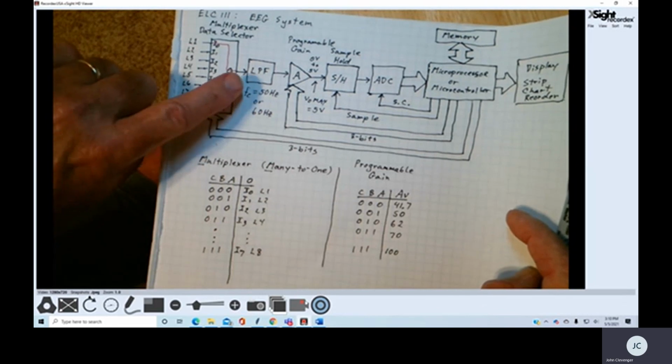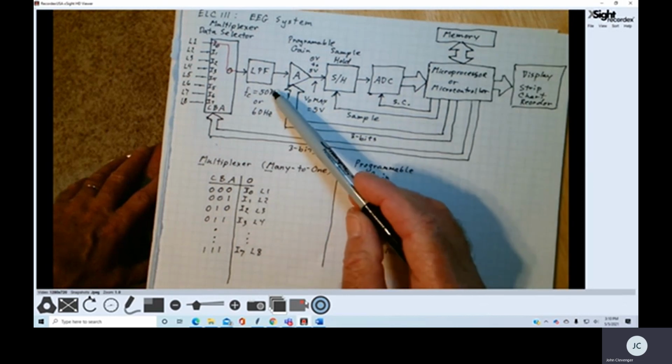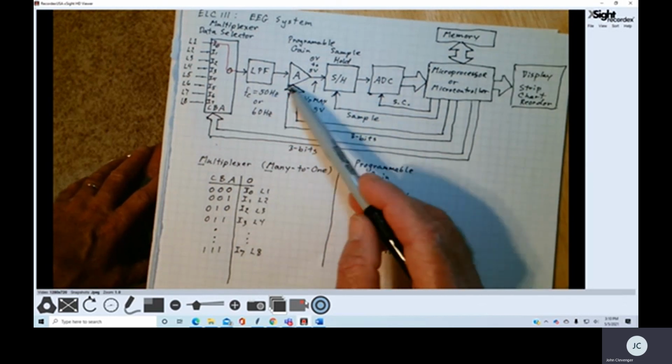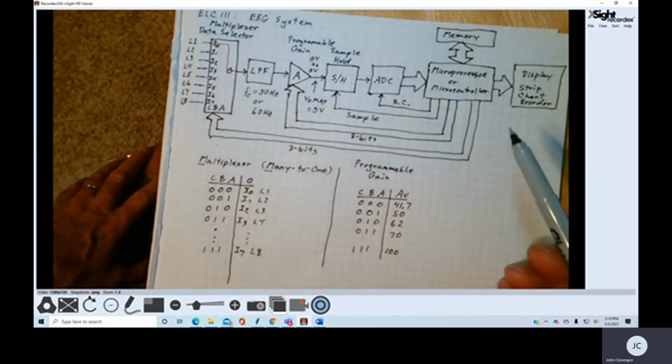We just take this low pass filter as this block. Don't really care about what's inside of here, the capacitors, the resistors. We don't worry about the transistors that make up the amplifier. Again, we only looked at the sample and hold because that was somewhat new information.